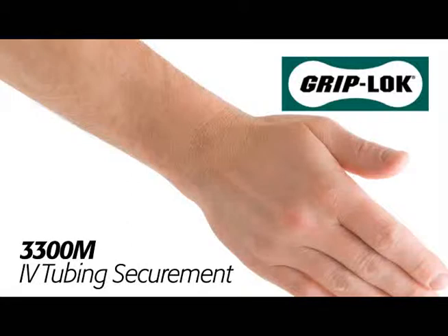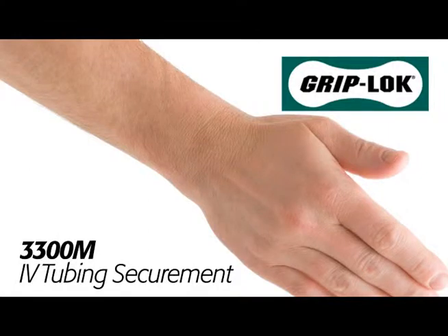Grip Lock 3300M for IV tubing securement. Note that it is important to prepare the skin according to hospital protocol and make sure the site is thoroughly clean and dry prior to Grip Lock application.